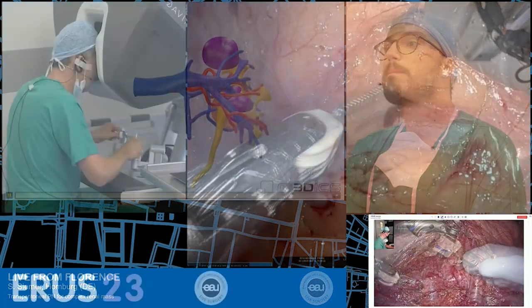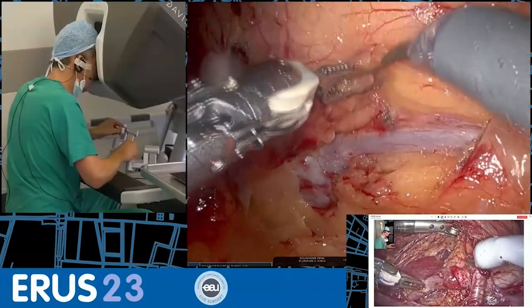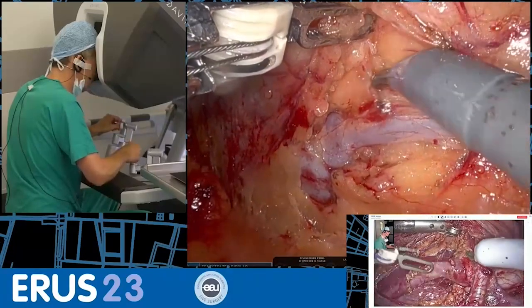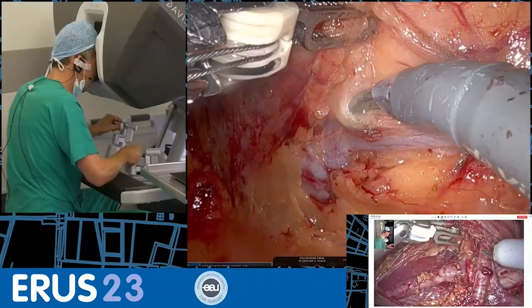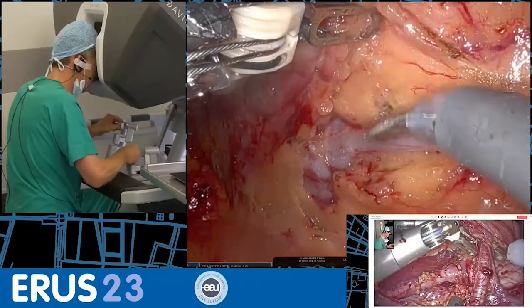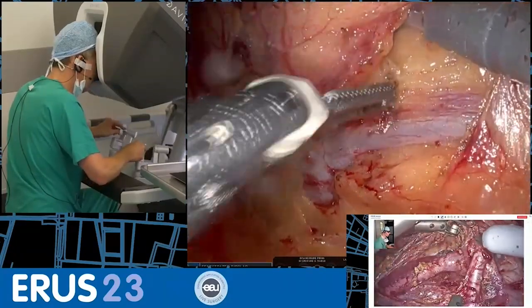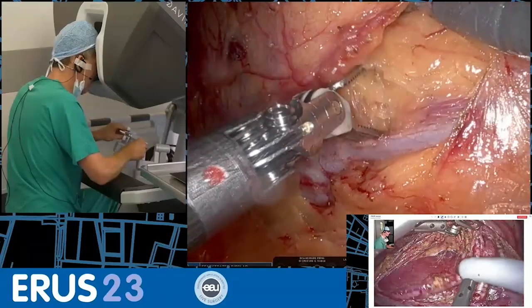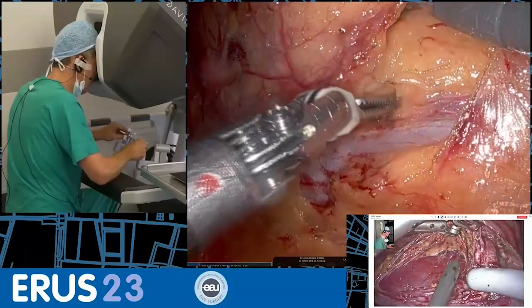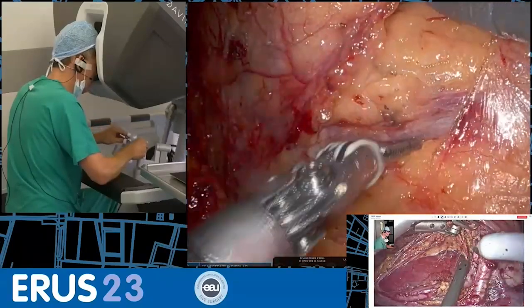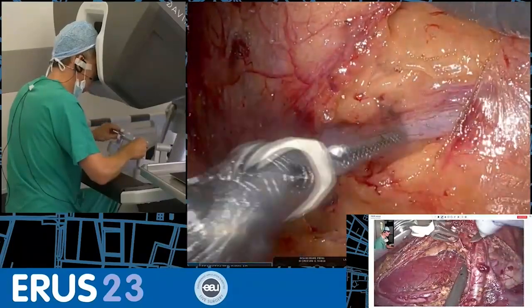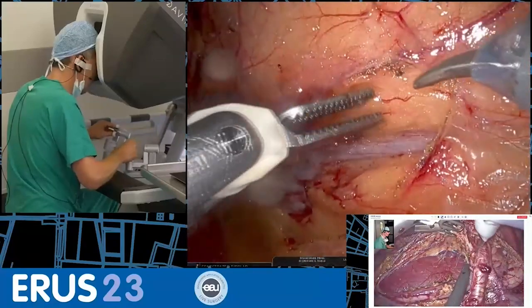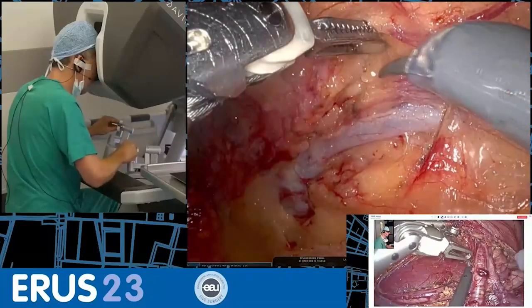What is your strategy on the isolation of the pedicle and on pedicle clamping? Looking at the images, what is your opinion about these two steps?